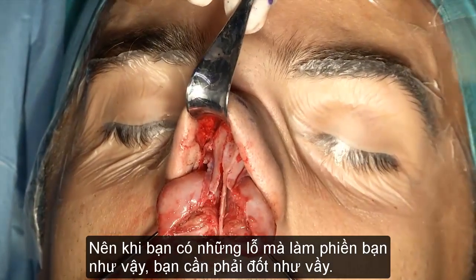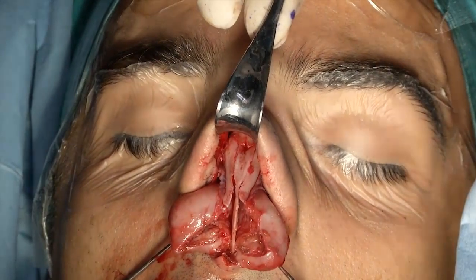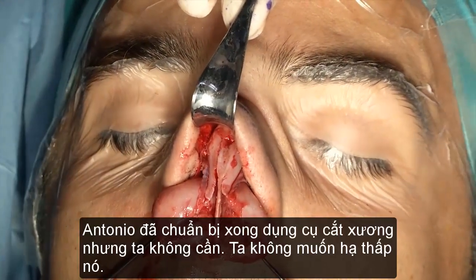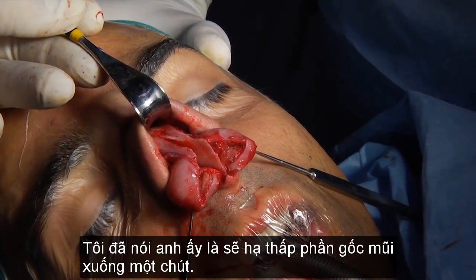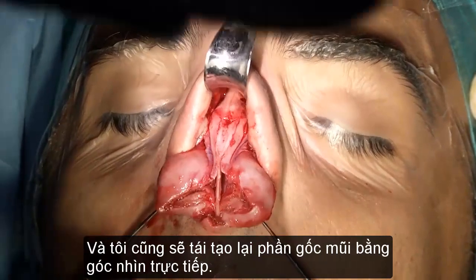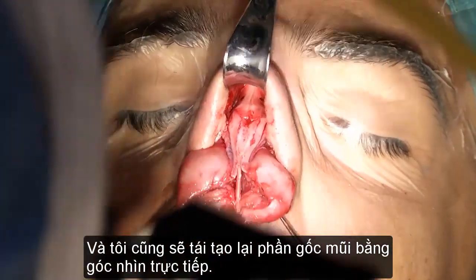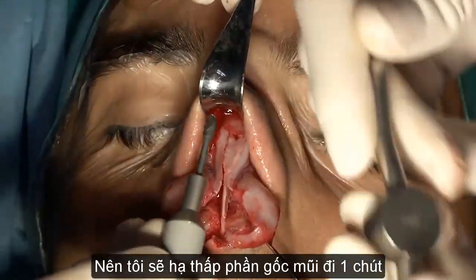So Antonio has prepared the striker saw, but we don't need an oscillating saw here. We don't need it, because we don't want to lower it. So I'll ask him something to take the radix down just a little bit, and I will refashion the radix just a little bit under direct vision. So I'm lowering his radix a little bit.